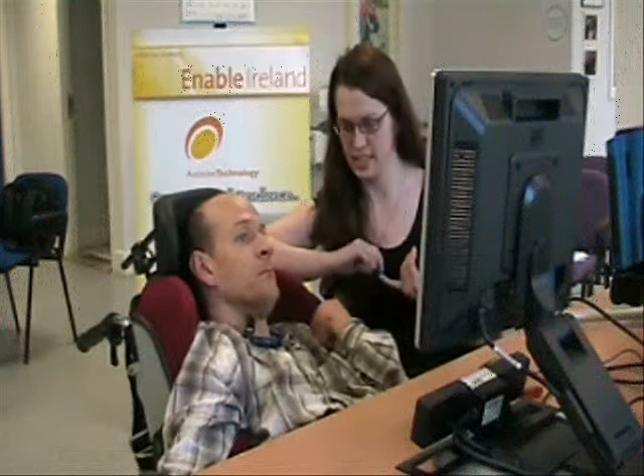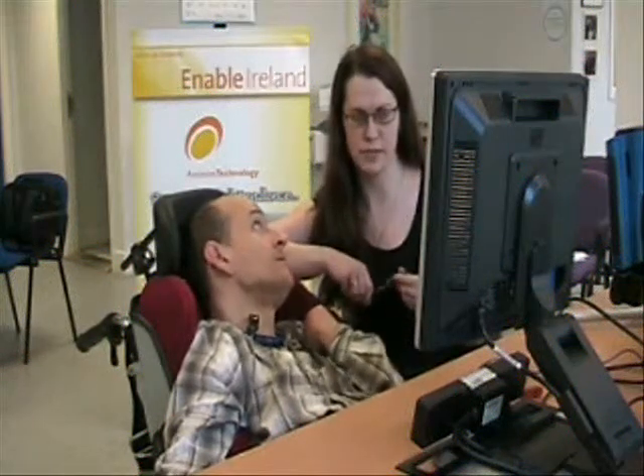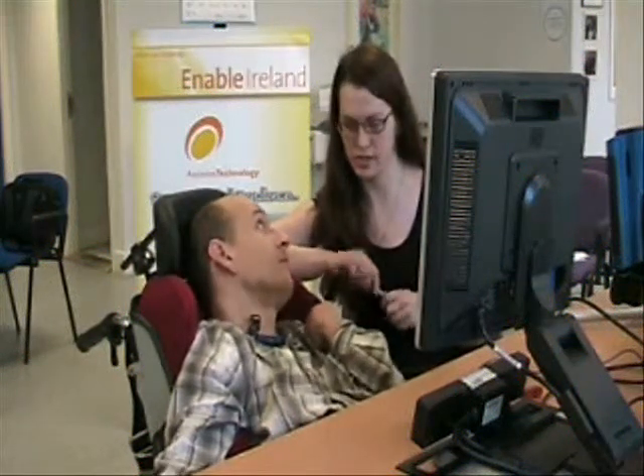Okay James, we're going to try a second eye gaze option here. So again, the same story will follow your eyes and move the cursor accordingly.